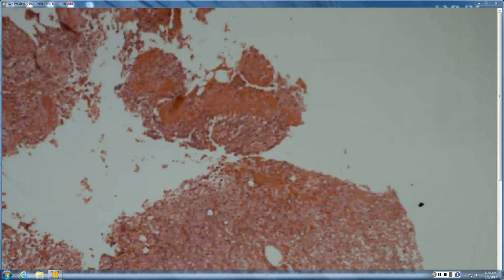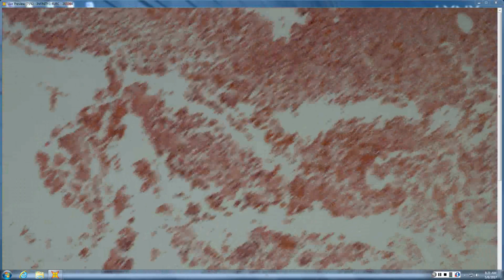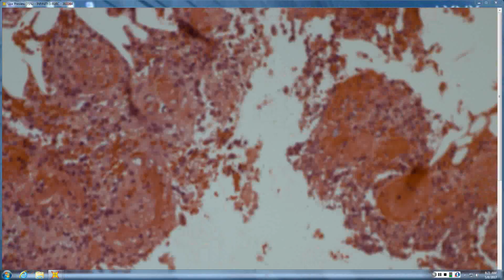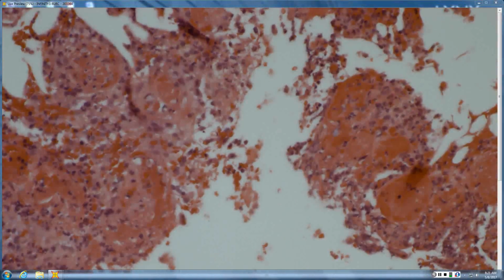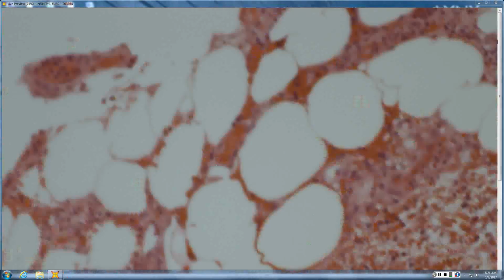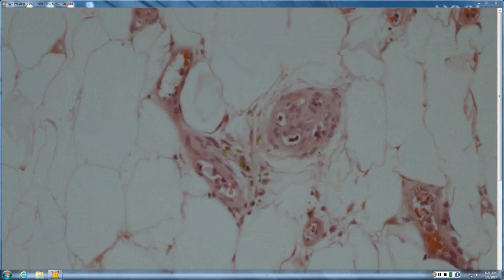So like tuberculosis, infection. Yeah, exactly. So infection's probably top of your list. And alpha-1 antitrypsin. Alpha-1 antitrypsin, excellent. So infection and alpha-1 antitrypsin, so you'd stain it, look carefully for organisms. Calciphylaxis can be subtle, and sometimes you have the secondary neutrophilic infiltrate, but I don't see a lot of thrombi.